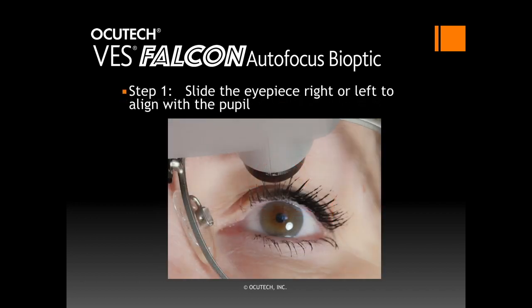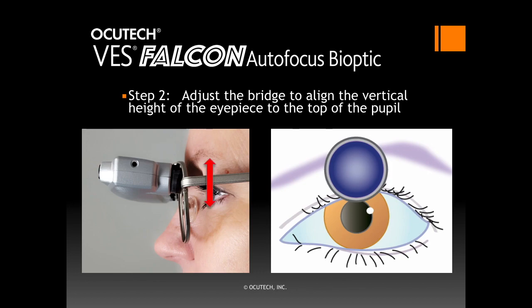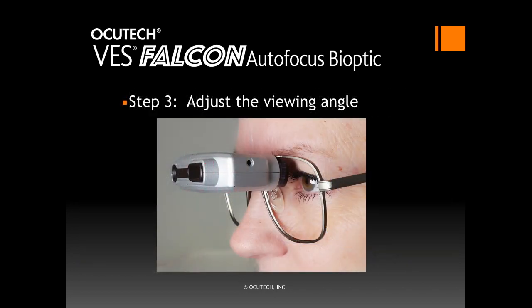There are just three easy steps to position the Falcon for your patient. In Step 1, after you have positioned the Falcon for the proper eye, slide the telescope right or left to center the eyepiece above the patient's pupil. I prefer to have the patient raise their head so I can look under the telescope to position the eyepiece. In Step 2, adjust the frame's nose pads to raise or lower the frame on the patient's nose so that the bottom of the eyepiece aligns with the top of the pupil. In Step 3, ask the patient to dip their head down to look into the eyepiece and adjust the viewing angle of the telescope by angling it up or down so that the line of sight of the user is parallel to the seam on the side of the telescope case.